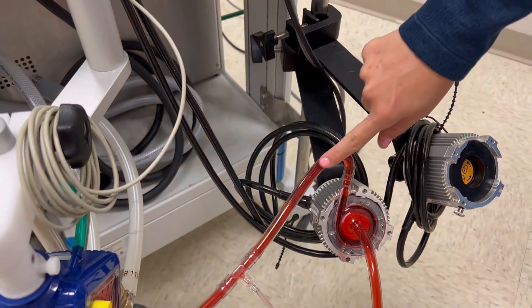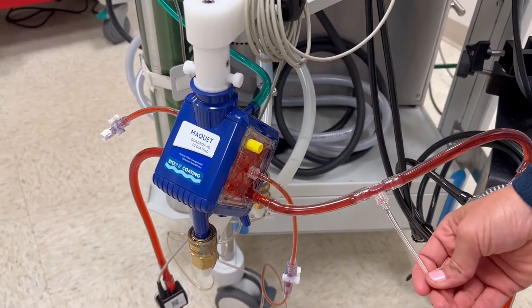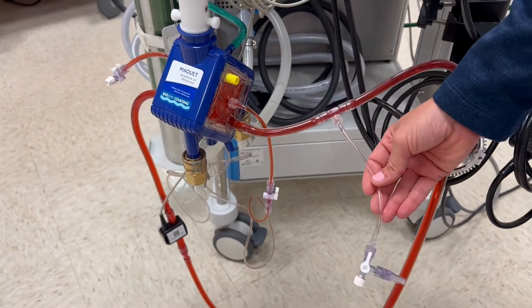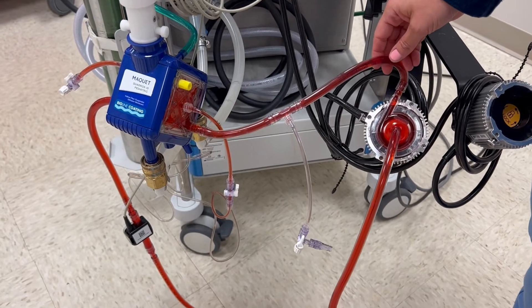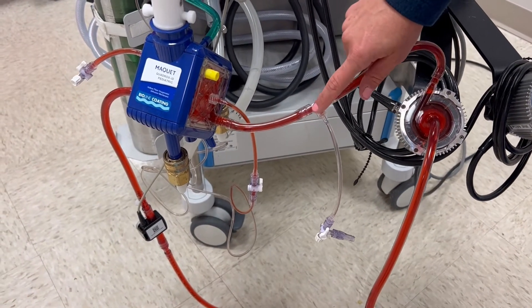Blood is propelled forward to our oxygenator. There are pit stops along the way with different pigtails so that we can do blood draws, do plasmapheresis, cytosorb, and anything along those lines of adjunct therapies for the patient.